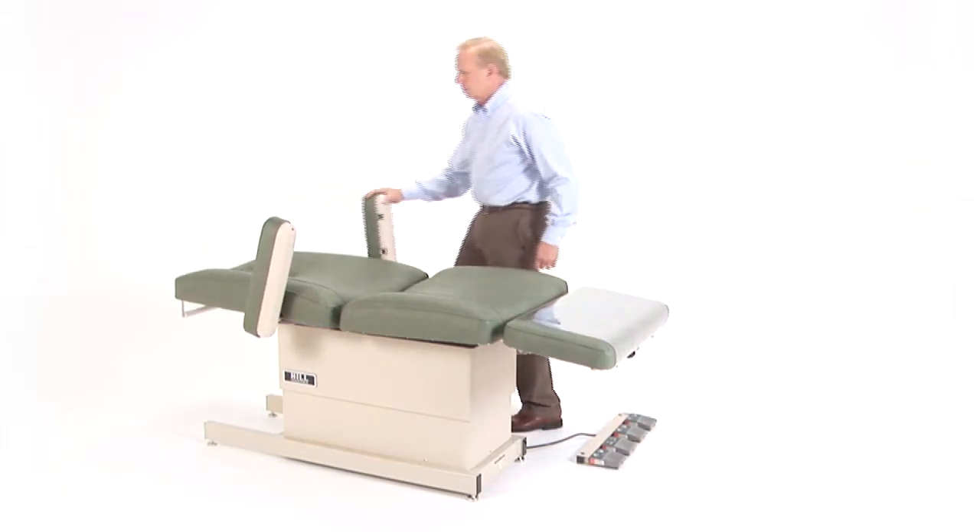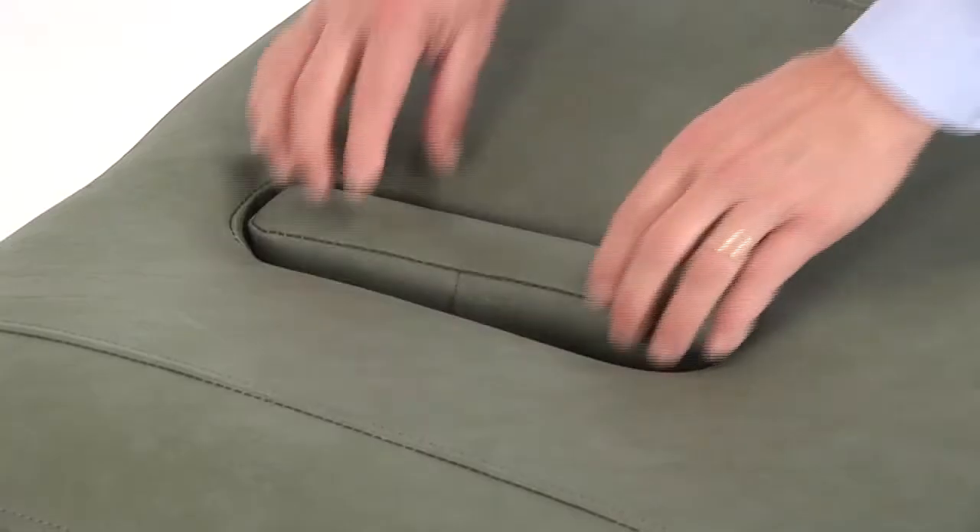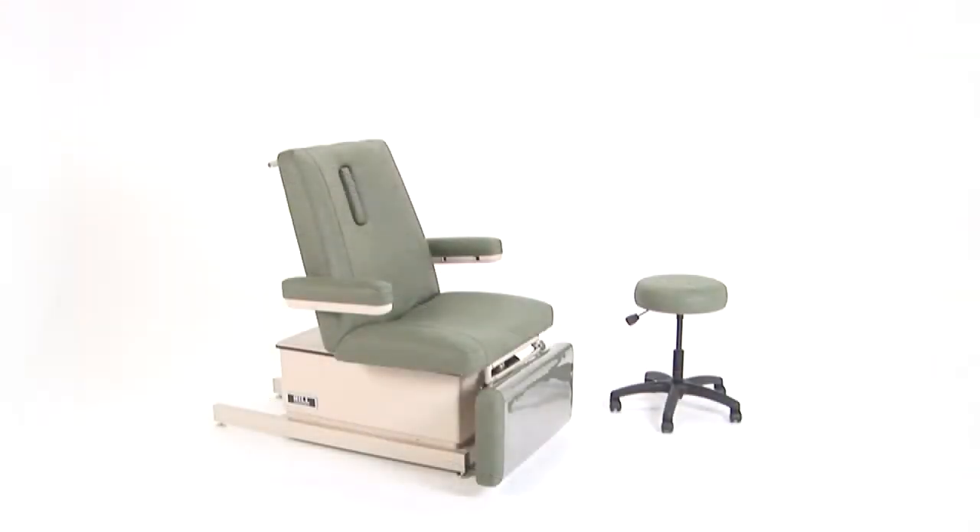When placing a patient in the prone position, the Hill Wound Care Chair can totally lay flat. There is a removable insert in the liftback of the chair that allows for a comfortable breathing slot.